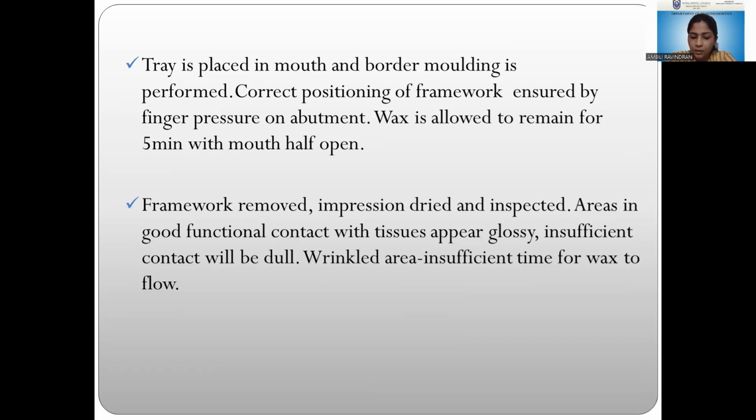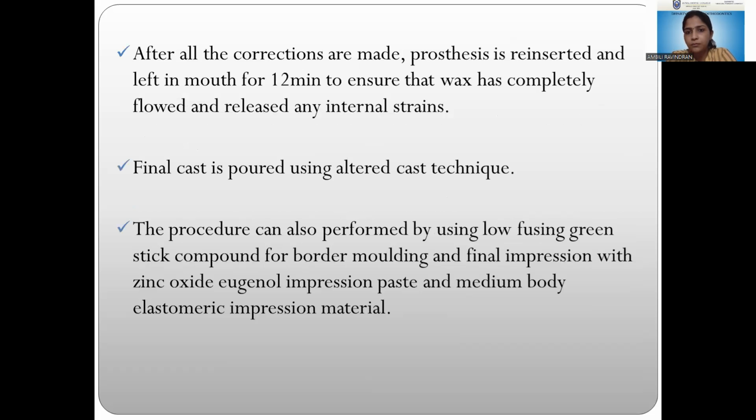If all the areas come in good contact, they will appear glossy, and if there is lack of contact with the surface, it appears dull, and a wrinkled area shows that there is inaccuracy, insufficient time for the wax to flow.